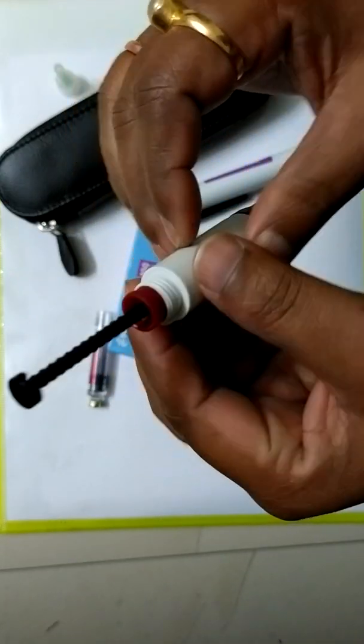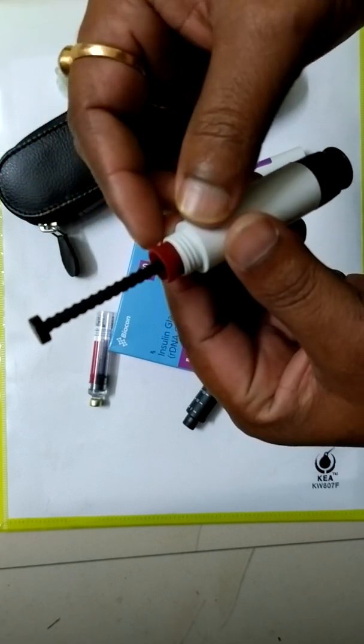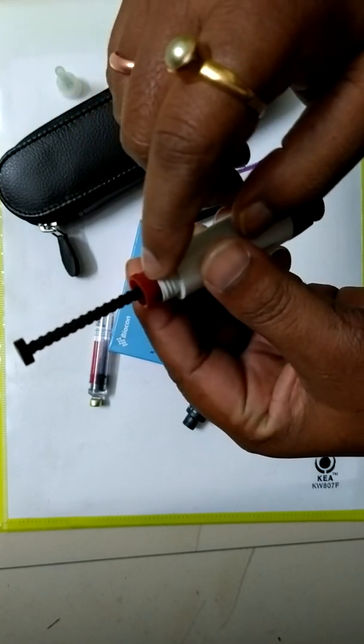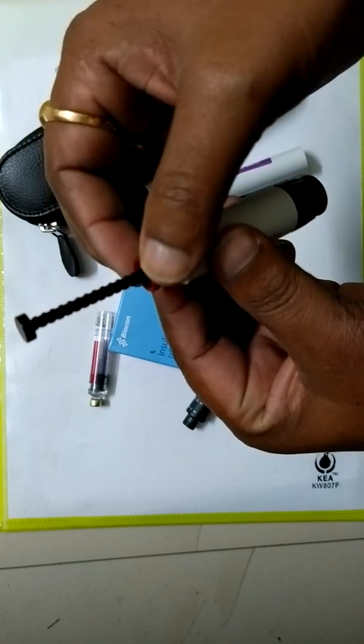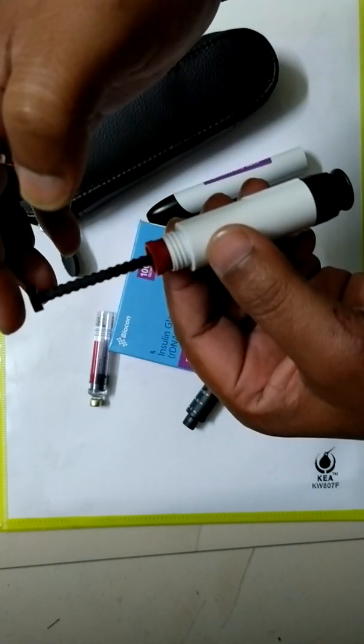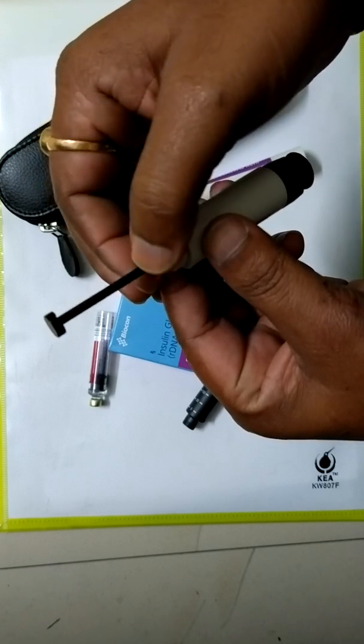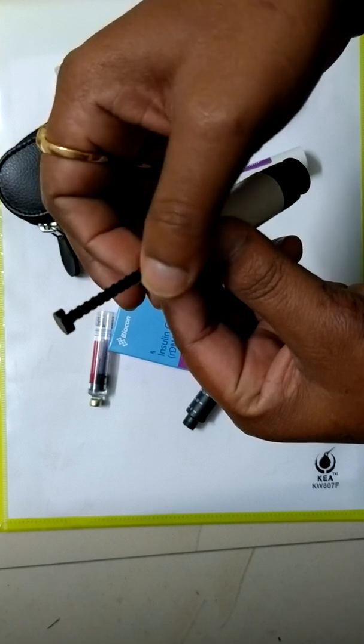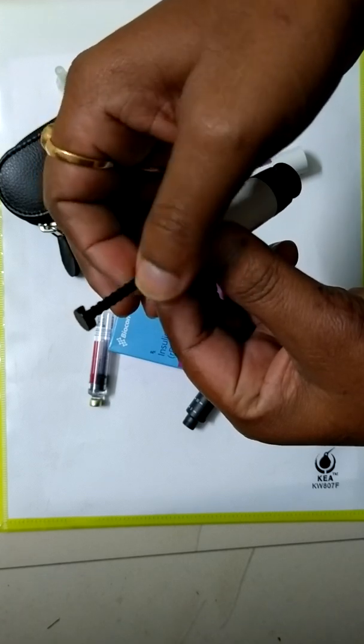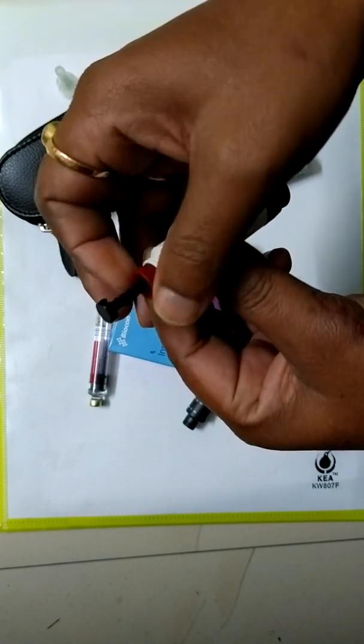Now for every time, set the plunger at the base by removing the plunger screw. Do not push the plunger head. Just remove the plunger screw. I am removing anti-clockwise and the plunger head is going down like this.